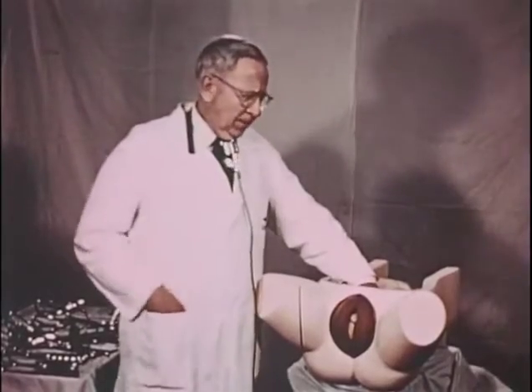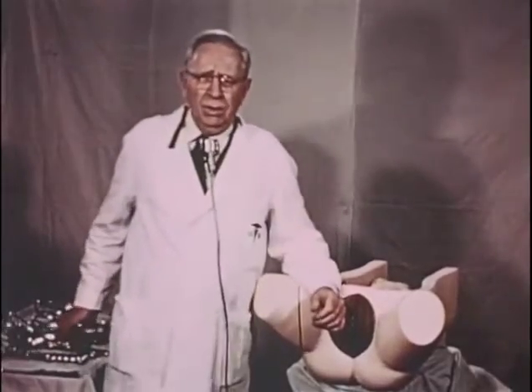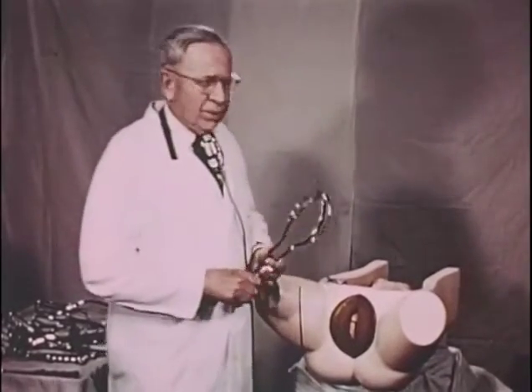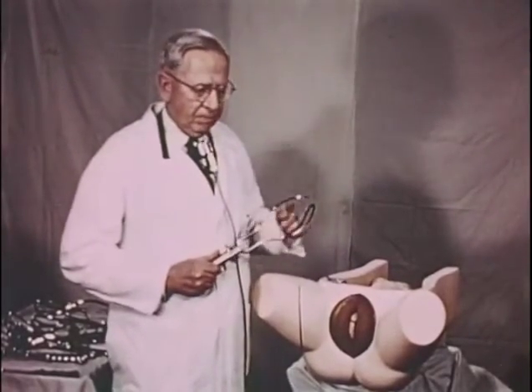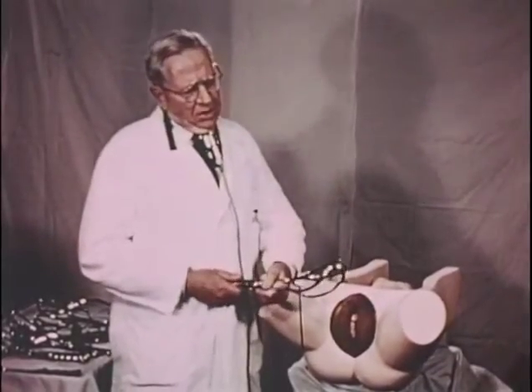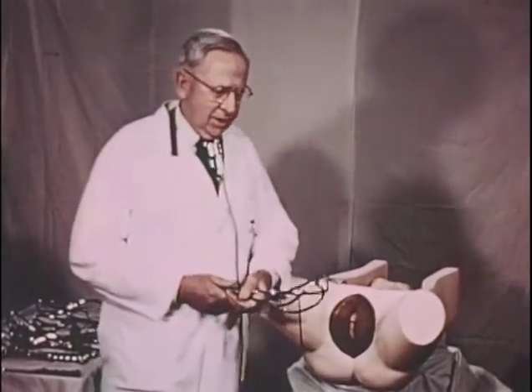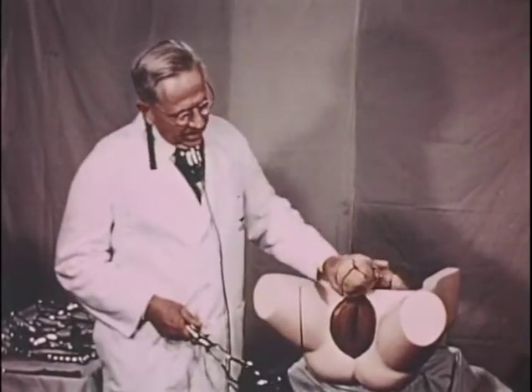Here we have a primipara, and in most primipara there is molding. Therefore, our choice of instrument in an anterior position with the head well down in the pelvis, according to our fifth prerequisite, would be a Simpson type because of the molding. In the technique of application, remember that we use the posterior blade technique. That is, the posterior blade is applied first, the one that goes behind the posterior ear in an LOA.